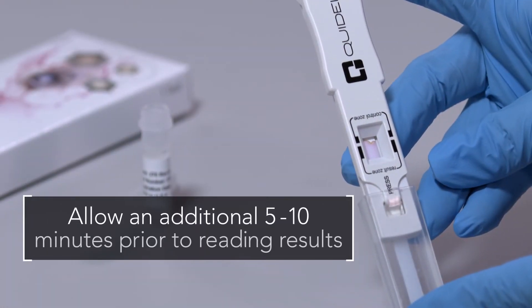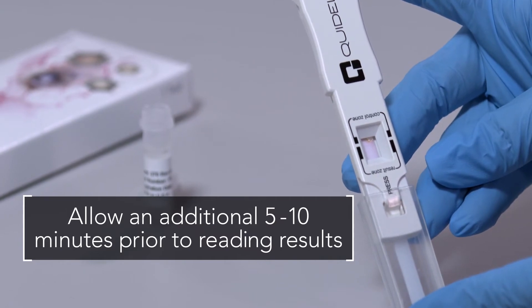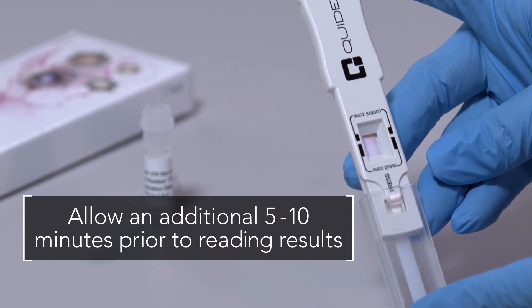If there is a streaky fluid wave in the background, or if a test is negative after 10 minutes, allow an additional 5 to 10 minutes of running time prior to reading results.